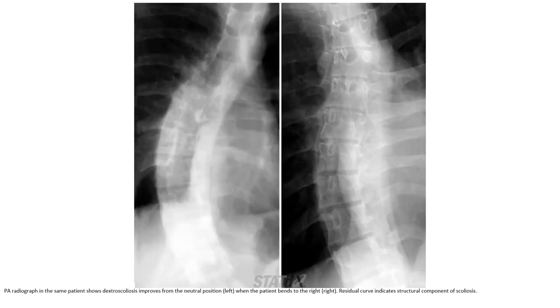PA radiograph in the same patient shows no significant change from the neutral position when the patient bends to the right. This curvature indicates a structural component of scoliosis.